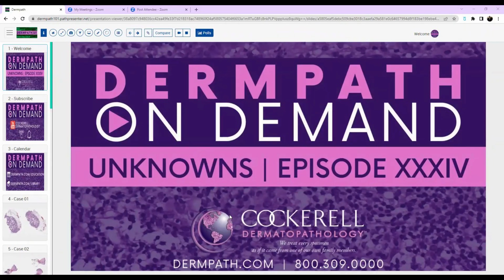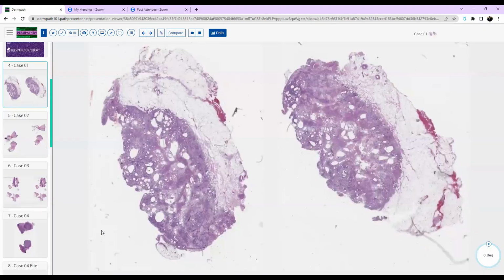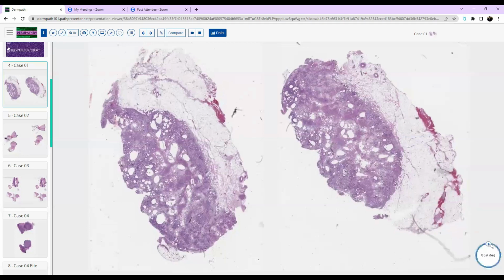Well, let's go ahead and get started. I think we've got a few people on the line here. We've got some good cases for you all this morning. So anybody want to start off with this one?